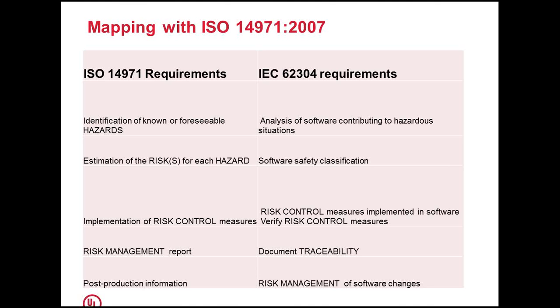Post-production information: here it is discussing risk management of software changes. Once the software is released, whatever changes you are going to make in the software, there is a certain maintenance process, pretty similar to the development process, that has to be followed for medical device software.